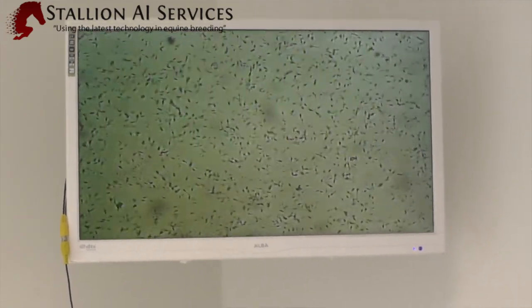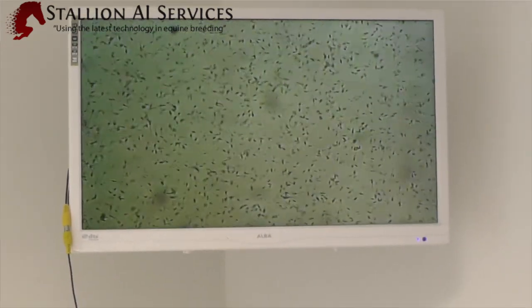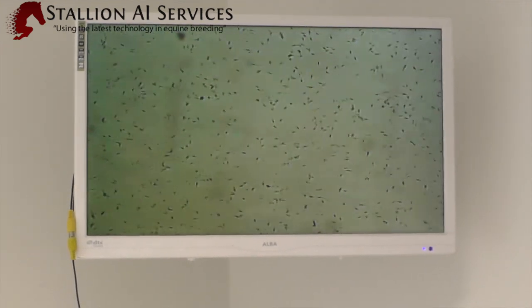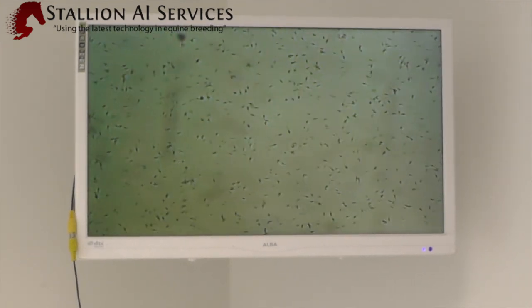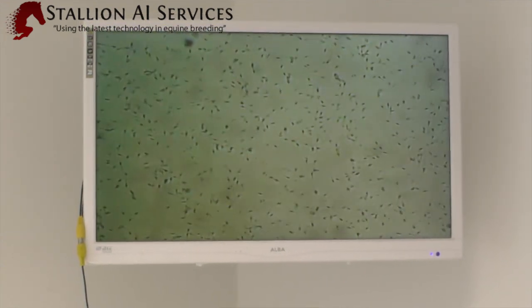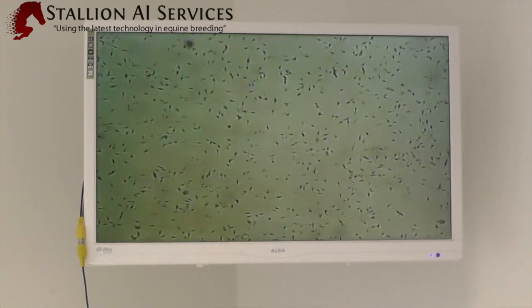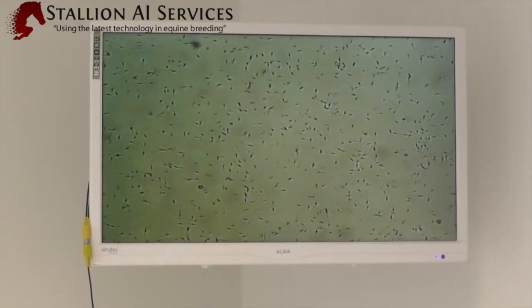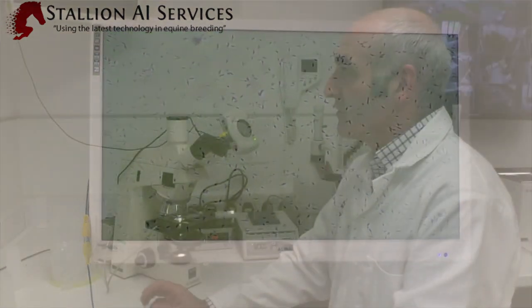The first slide is about 37% progressively motile. The second slide is about 30 to 35%. And on the third slide, it's 37% again. This gives us an average of 36% progressively motile sperm.